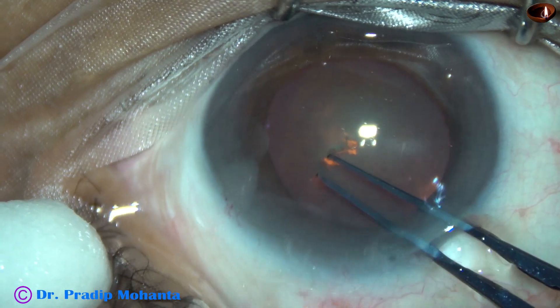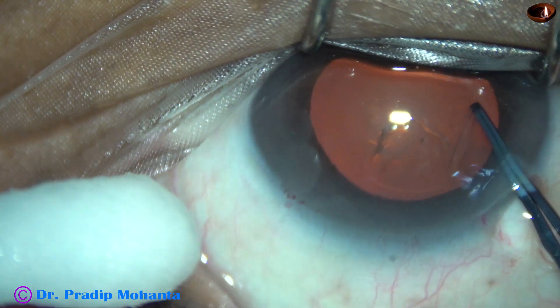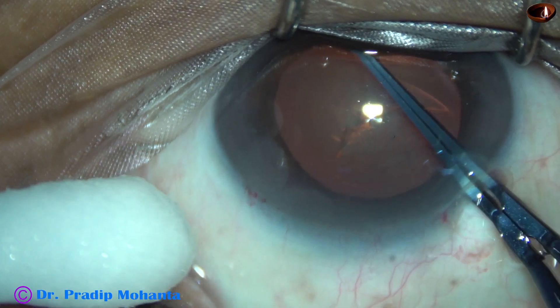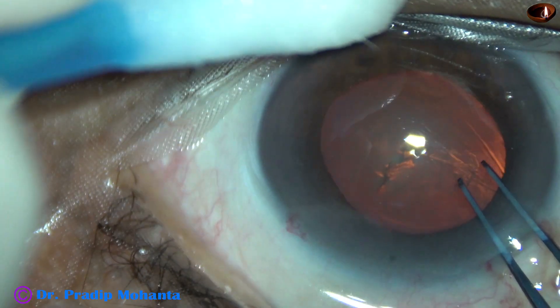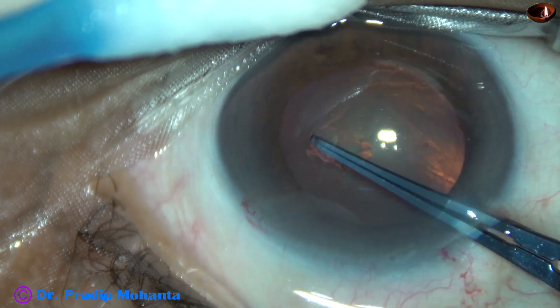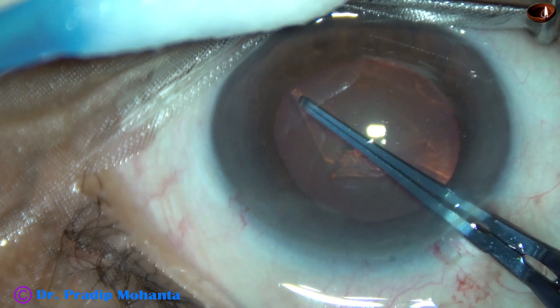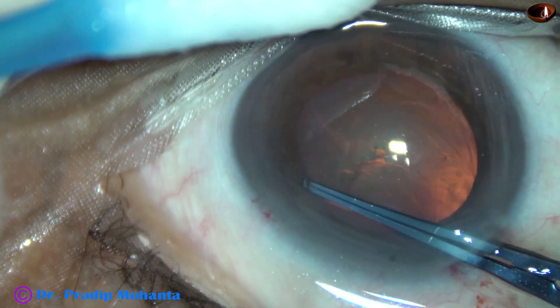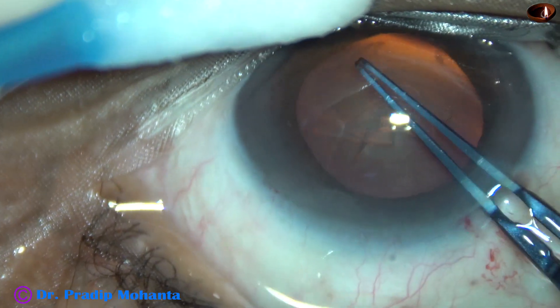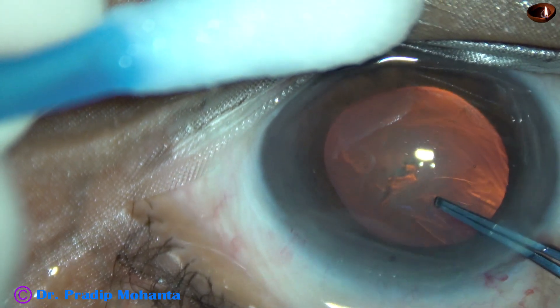Now capsulorhexis: raise a tag with the utata forceps, hold the tag, guide the tag anti-clockwise all around and do an optimum sized capsulorhexis. The pupil has dilated to about 6 millimeters in this case and the size of this rhexis is about 5.5 millimeters.